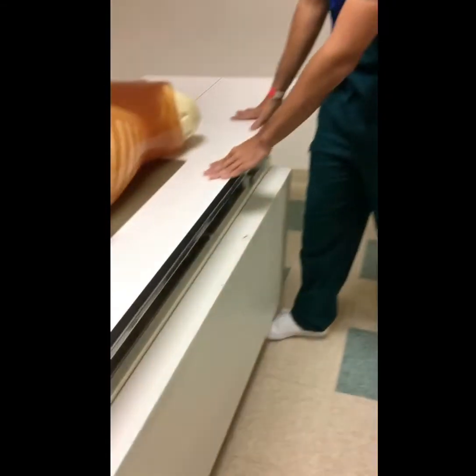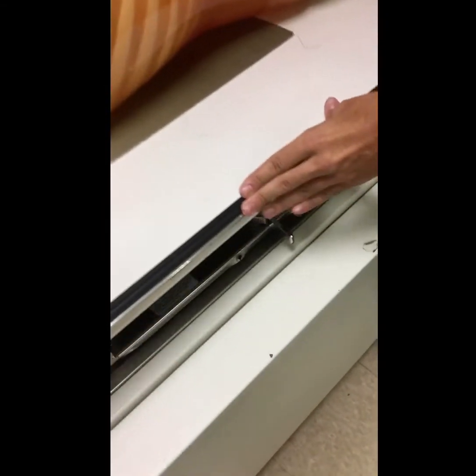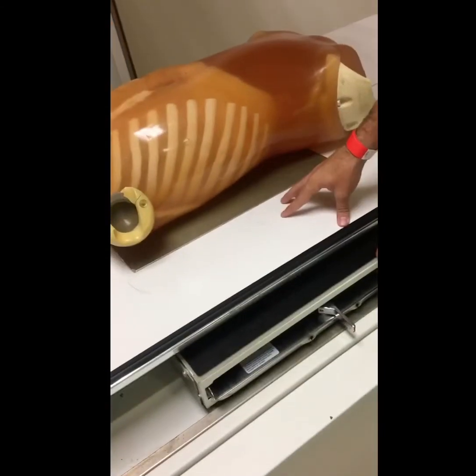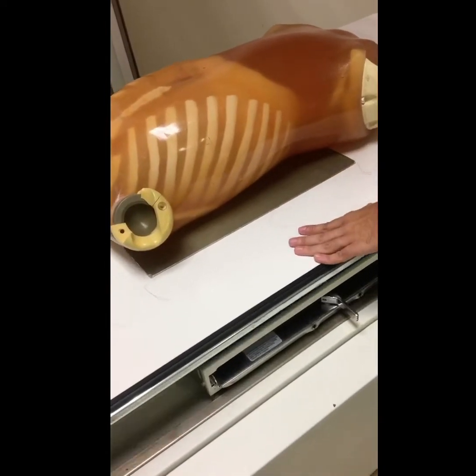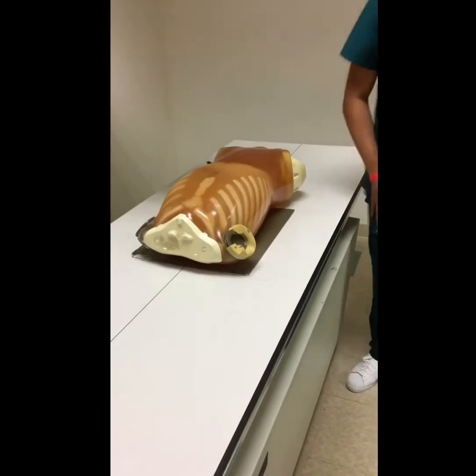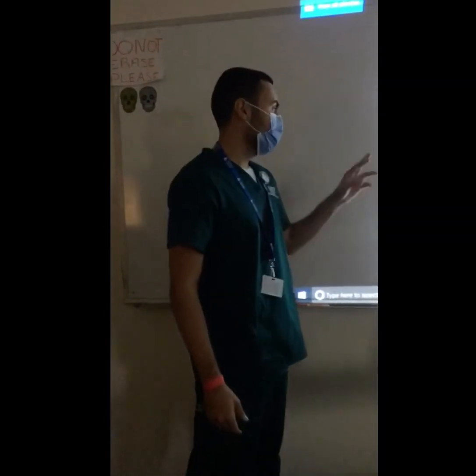So here we have the grid underneath here, and with this one here we're gonna make the double grid, and sometimes it is hard to align them, but now we're gonna go over the image. Okay, so here we have the Moire effect.